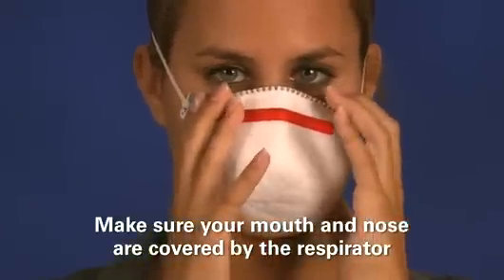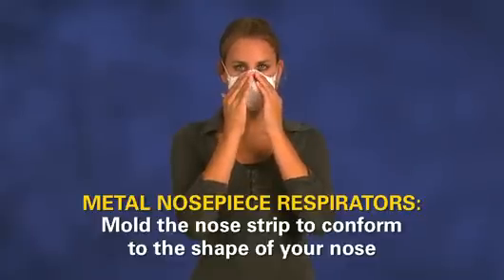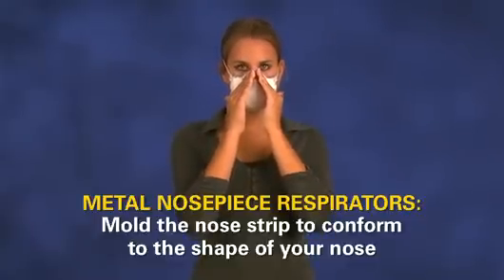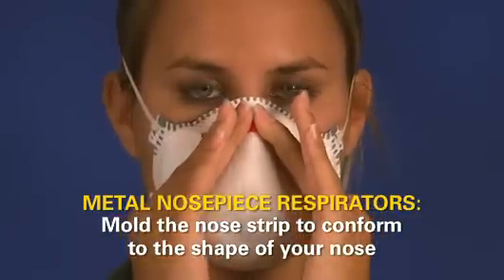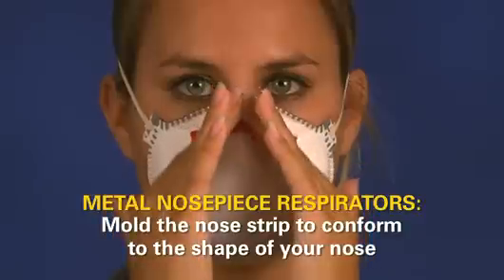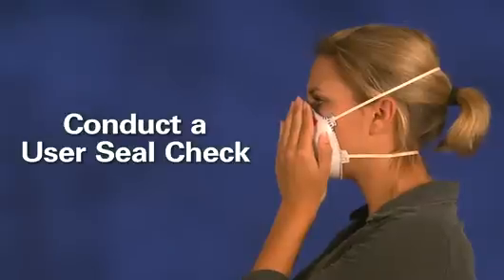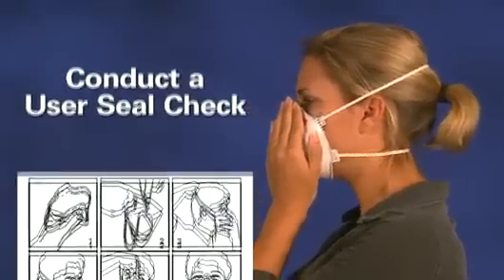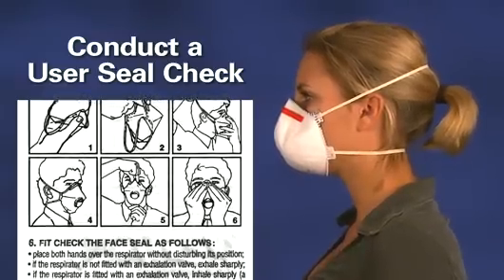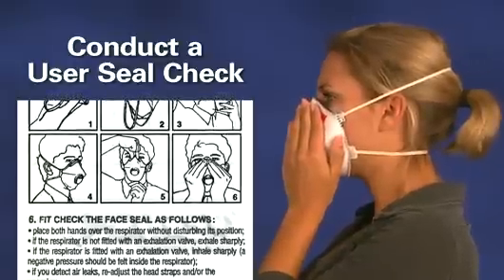Make sure that your mouth and nose are covered by the respirator. If the nose piece has a metal strip, use both hands to mold the nose strip to conform to the shape of your nose by pushing inward while moving your fingertips down along both sides of the nose piece. Next, conduct a user seal check. It's essential to follow the manufacturer's user seal check instructions because the manufacturer knows the best method for checking their respirator.